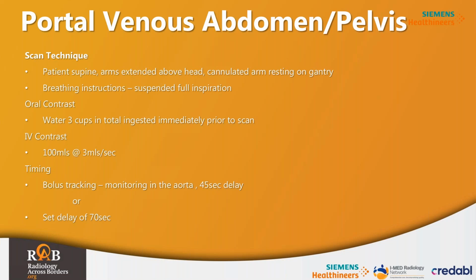Again, scan technique: patient supine, arms extended above head, breathing instructions, suspended full inspiration again. Now, a lot of sites won't do this. Best practice would be to give them 3 cups of water just prior to the scan to fill the stomach with water. Very few practices would do it, but it is definitely best practice.